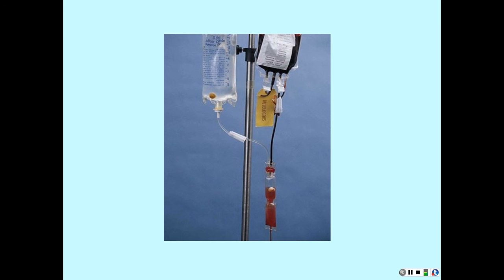So either you've got to stop your other IV fluids that are infusing and hook this one up, or you've got to stick your patient again. Most of the time, it's okay to stop your other fluid. And if you have an extension set on there, you just unhook it and hook this one up to it. Okay? But you do not piggyback this into anything or piggyback anything into this.